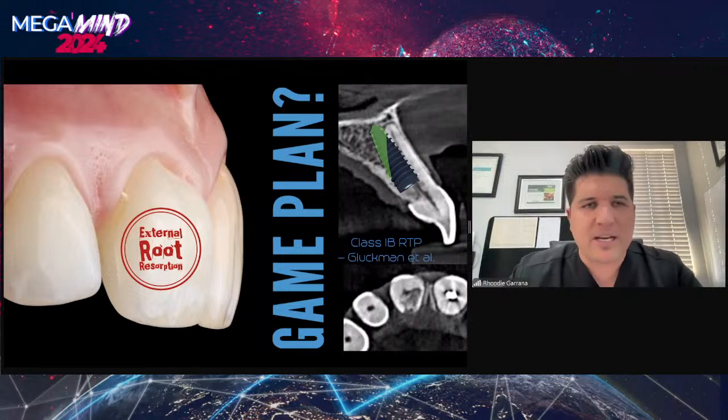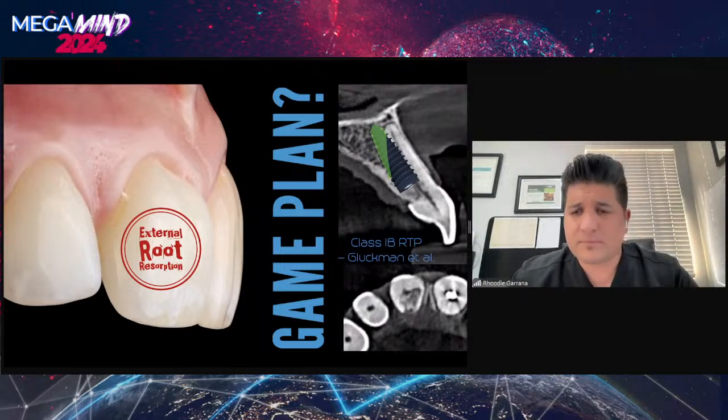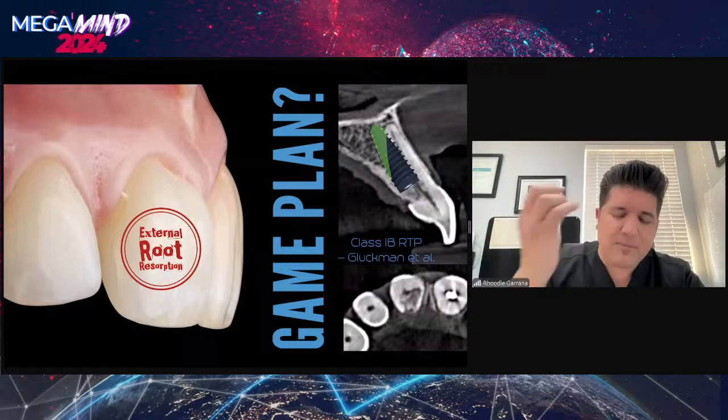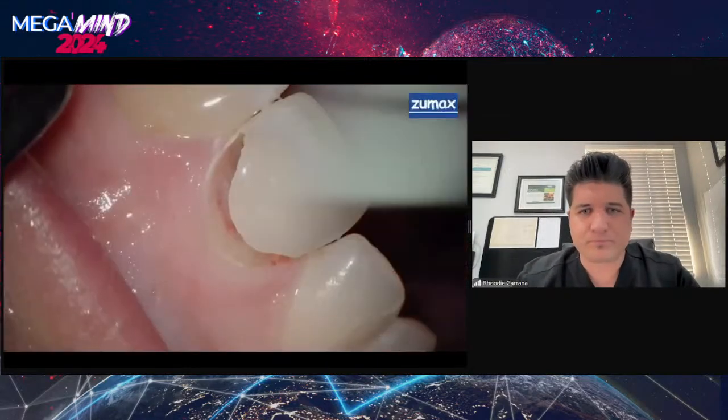Because of the thin biotype, I've got several options available to me. Do we go with a socket shield? Do we extract the tooth in its entirety and do dual zone technique and the sandwich technique as the Swiss recommend, or do we go with dual zone therapy? Socket shield, obviously a firm favorite of mine in cases where we want to maintain the surrounding tissues.